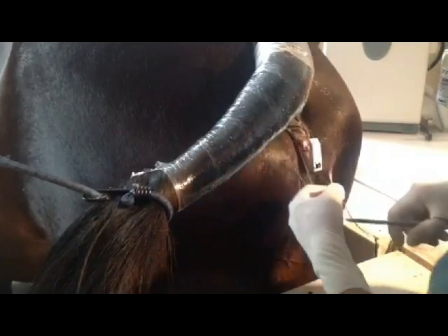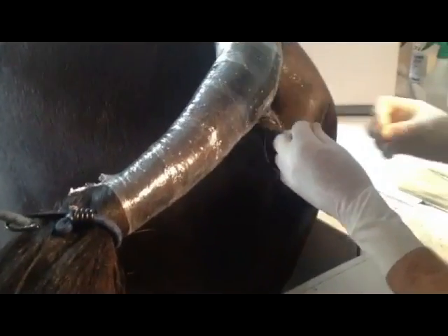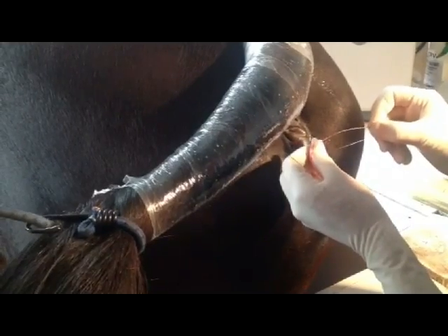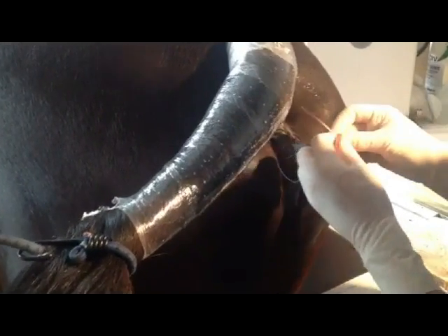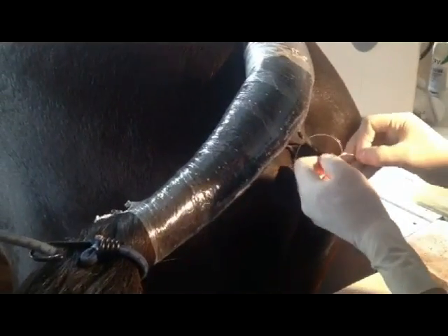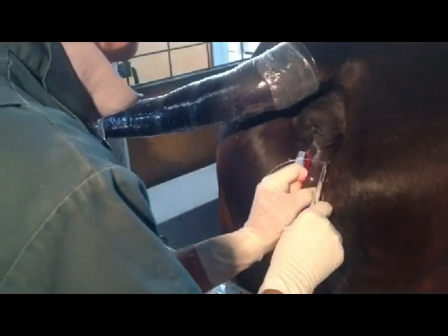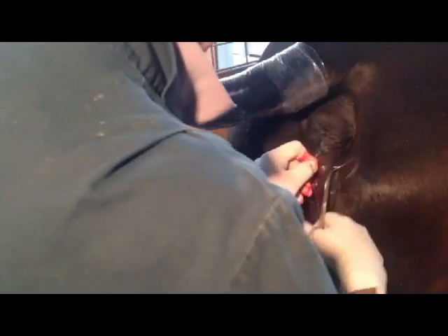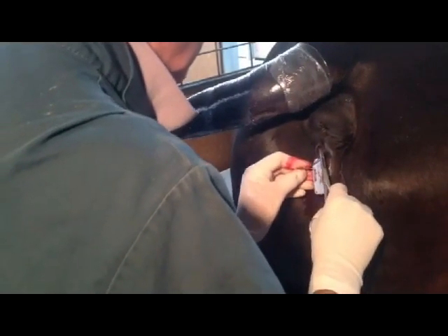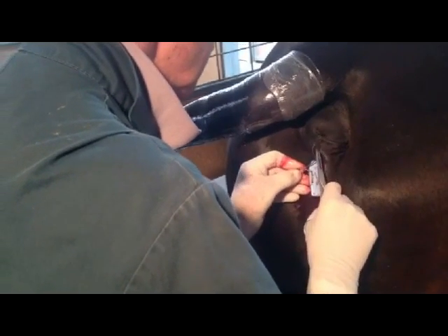One of the wee tricks we've learnt with these foaling alarms is that we actually attach them to the vulva with a button. In the early days, before we used a button, we had the odd one that would tear the vulva. By using these big shirt buttons, that has eliminated that. The alarm goes on one side of the vulva, and then on the other side we attach another button, and that goes onto a magnet which is inside that little blue box.